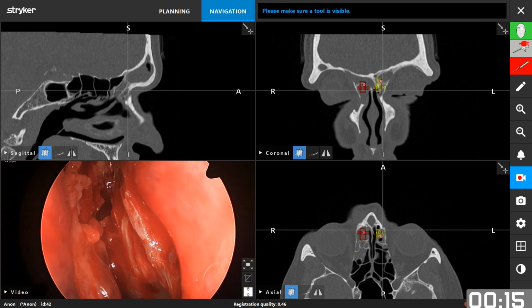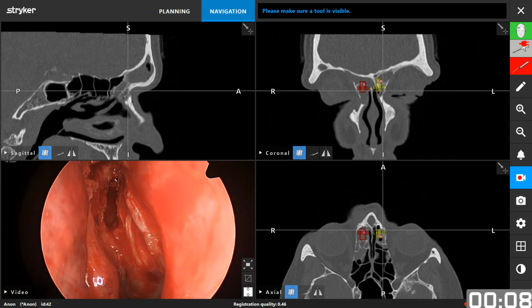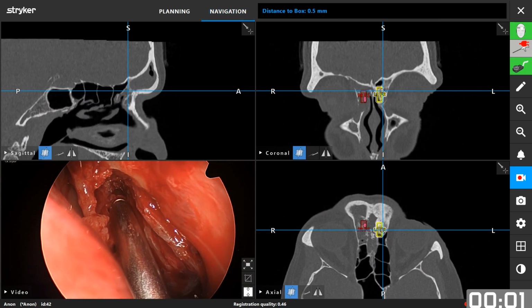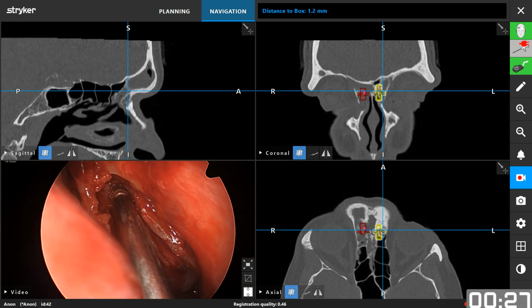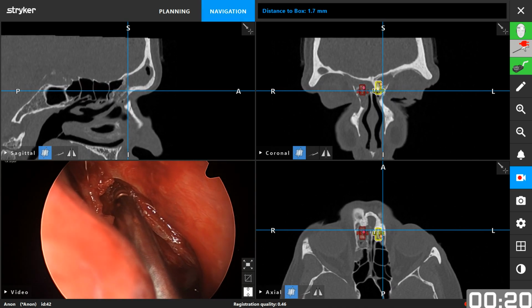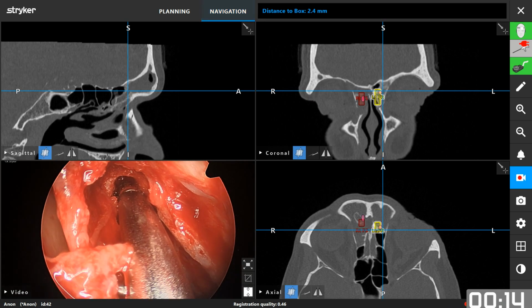The frontal recess is almost open, but still narrow. We need to drill more bone. Everything superior to us, or above us, is the frontal beak, and it's very thick with the osteitis area. In the back you can see the nice looping skull base, so just be aware of that. Okay, we're now above the bulla, so what's behind us will just be the skull base.